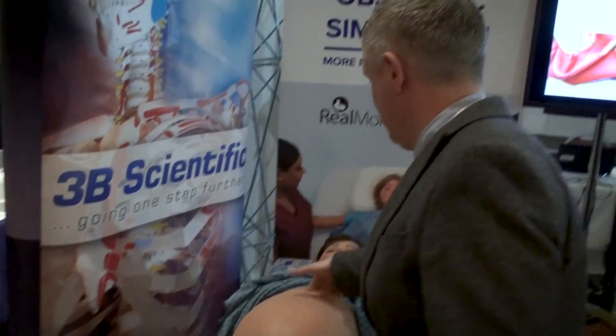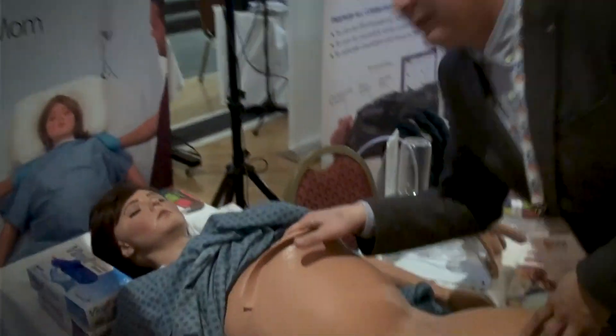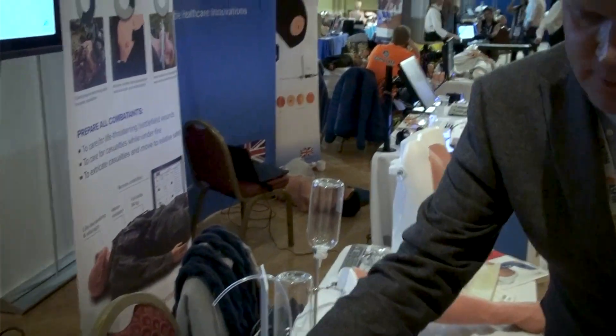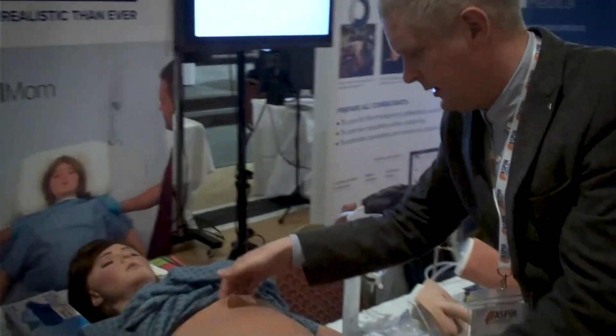Within this mannequin — the new one is a lot easier to open — you can get inside and have a look. Then you basically load the baby up inside. I won't do the full process now because I'm getting covered in lubricant.